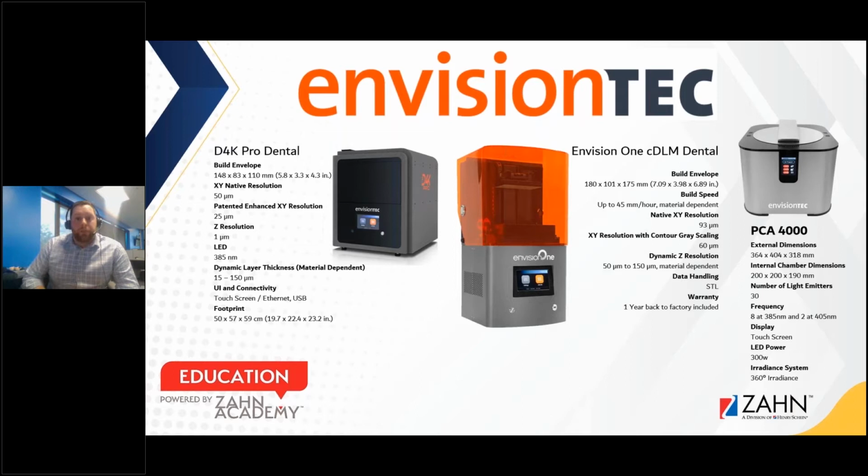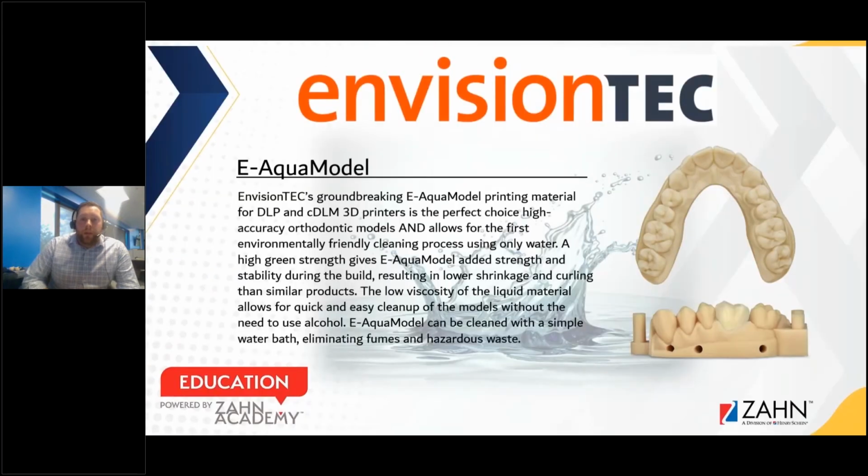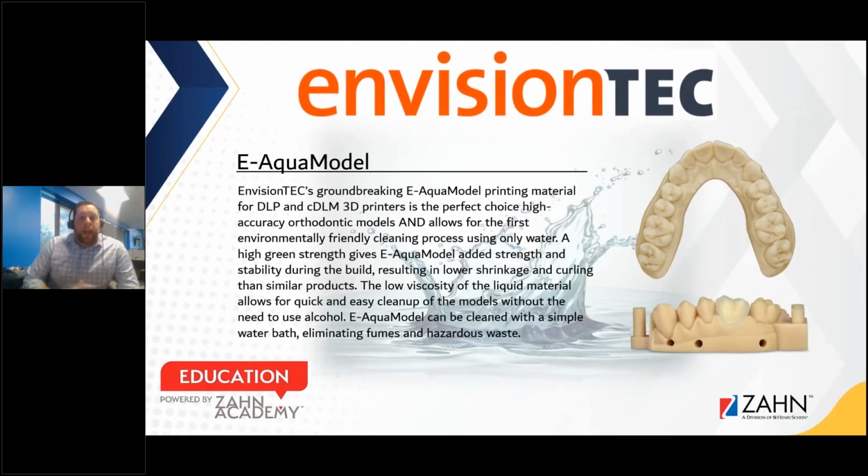Digital dentures go into the printing process, so this is going to be something really good for us. Going from there, we already know that EnvisionTEC had these printers, but they're going to be developing this new style of printing materials that we see here, which we're going to see more so with the E-AquaModel, but other materials down the line.